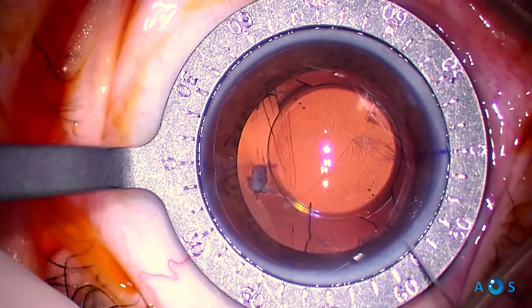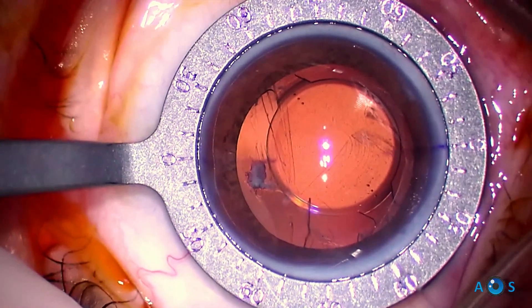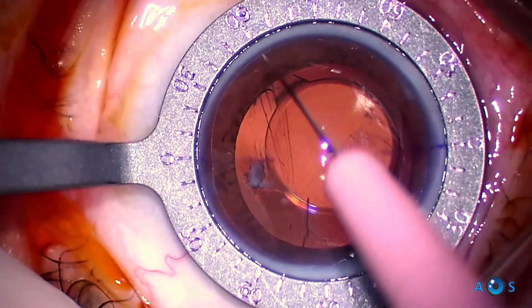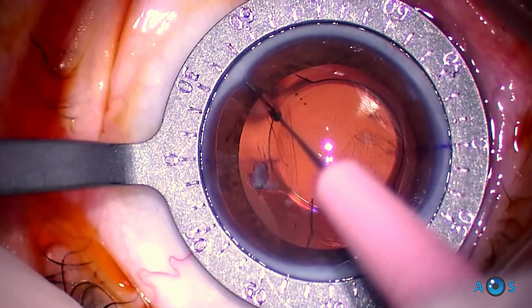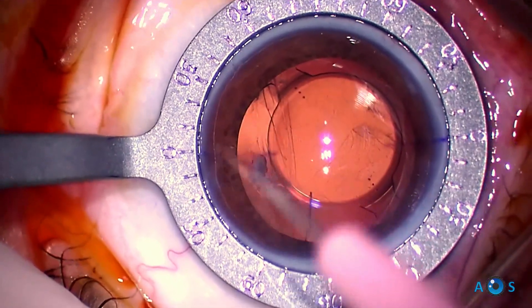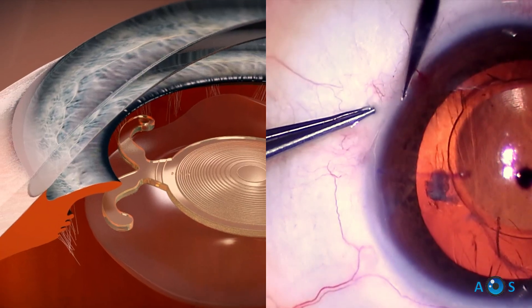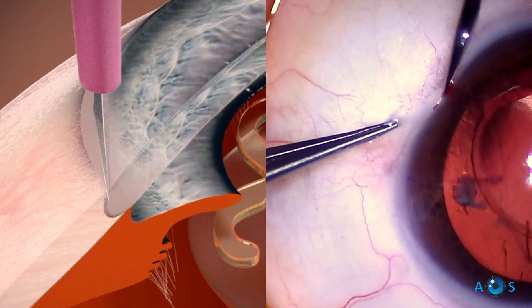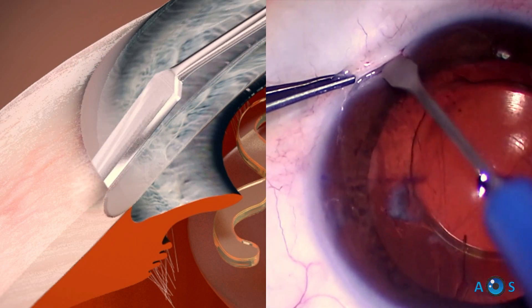A 68-year-old female patient with a two-year-old Physiol FineVision POD FT IOL implant started to develop insidious anterior capsular phimosis at the beginning, which was managed with Nd:YAG anterior capsulotomy. However, rising positive dysphotopsia complaints came along.